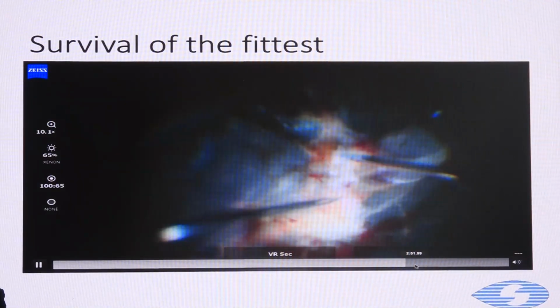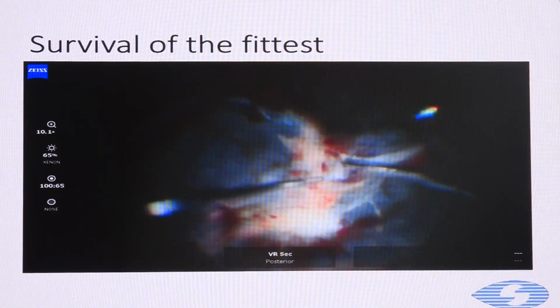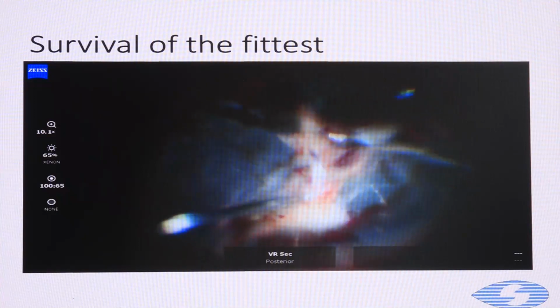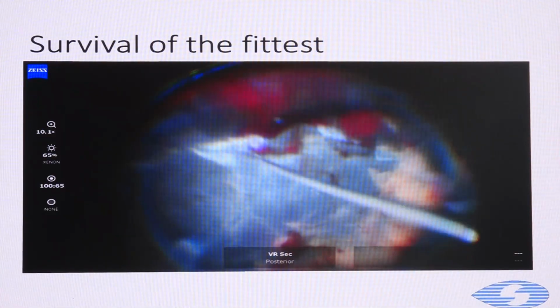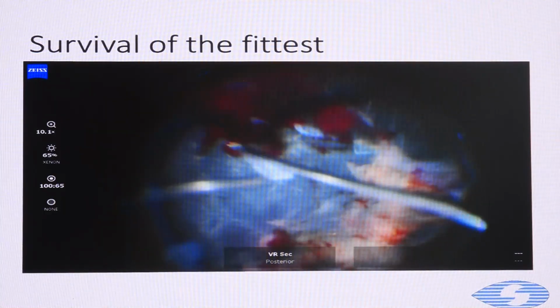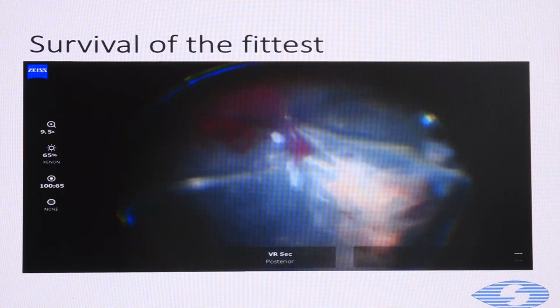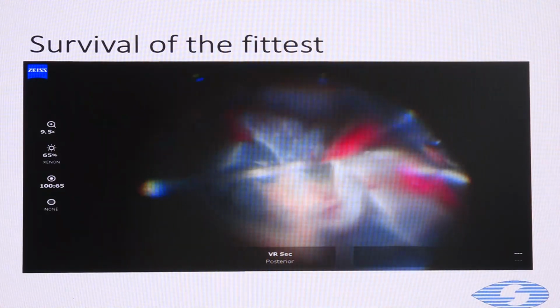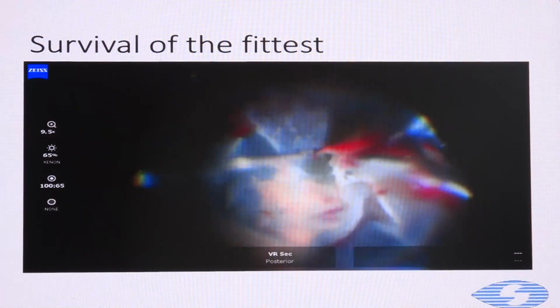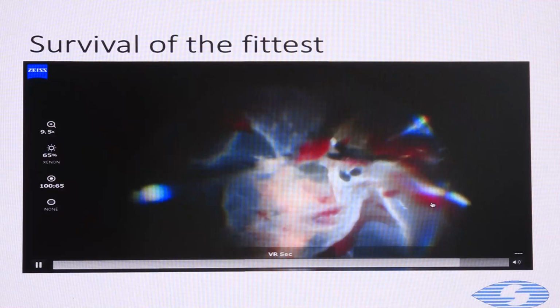Now we're coming to the first nasal edge. The nasal edge was extremely tight, and when we were taking care of it, I realized that there's a big round mass posterior subretinally. So I went ahead with very aggressive dissection at this point, because I was thinking that it's imperative that we take off all the fibrous tissue and the vitreous, and probably have a break over there, a retinotomy, to tackle the subretinal membrane.